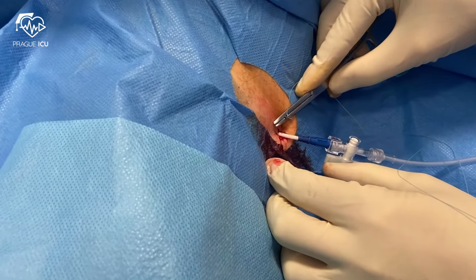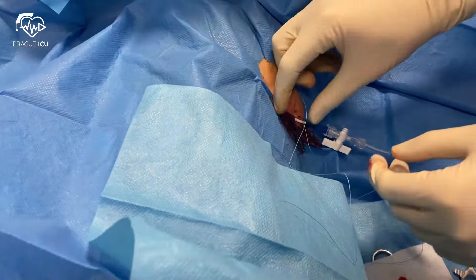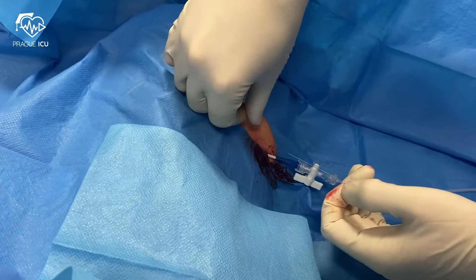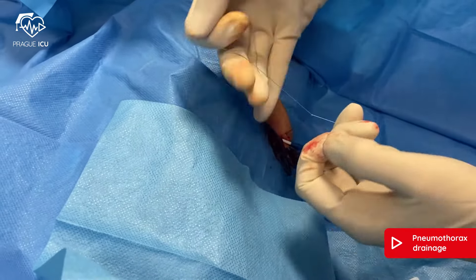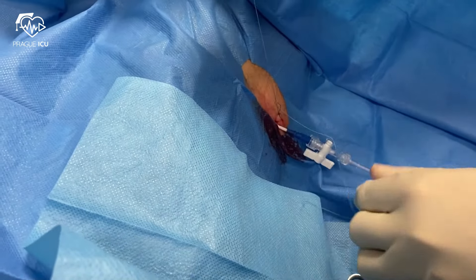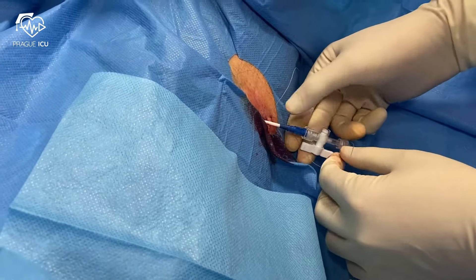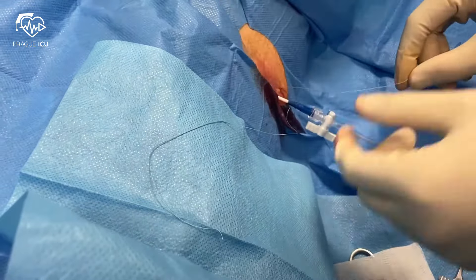Finally, secure the chest tube to the skin. The three ends of the sutures are wrapped around the tube.